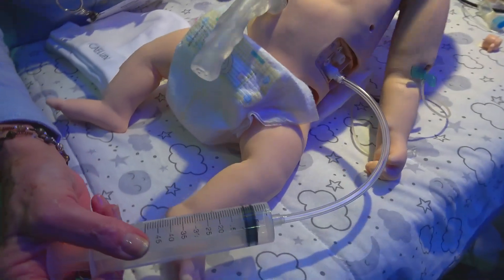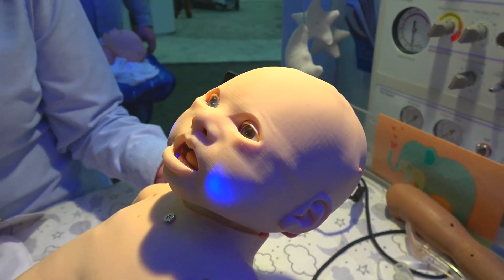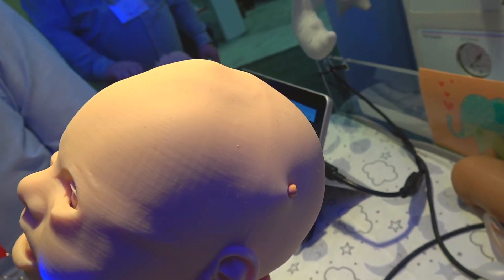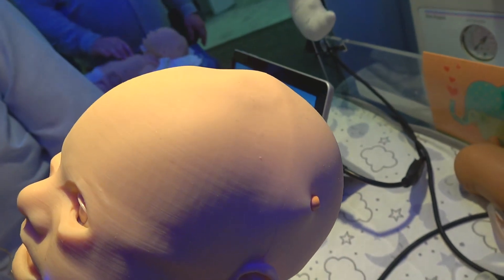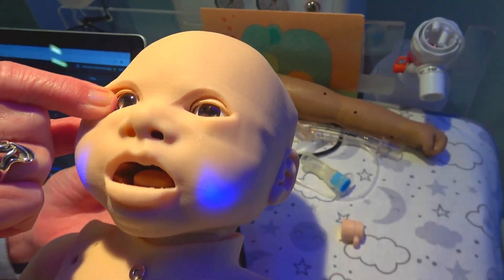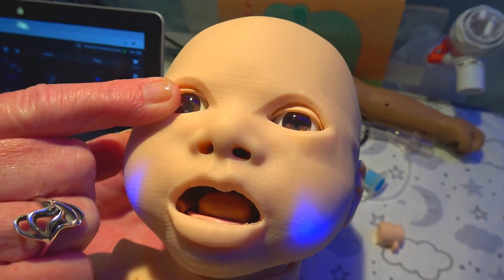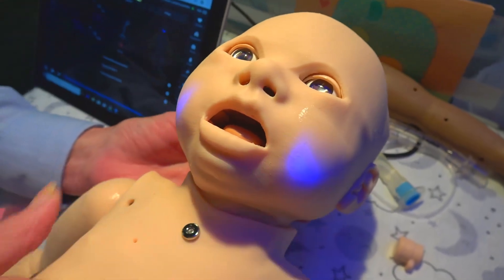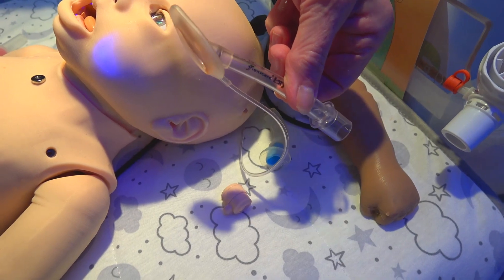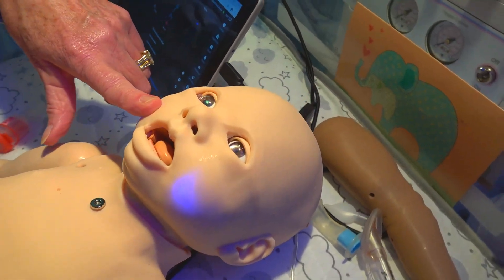Starting with the head, we can provide a bulging fontanelle or a sunken one — you set it at whatever height you want. We have tri-state eyes so the pupils can move from normal pupil size to pinpoint to blown. There is a full airway so Luna can be intubated and can also use all other oral adjuncts like an LMA, a nasal pharyngeal airway, and an oral pharyngeal airway.